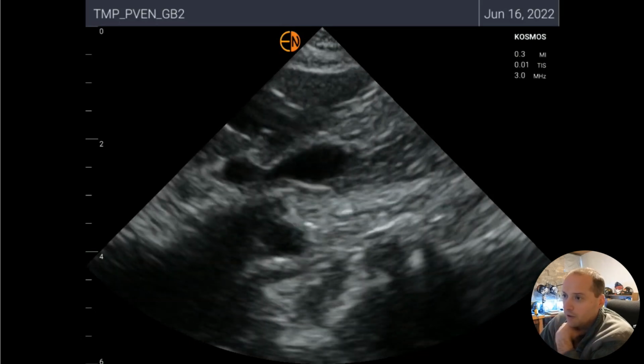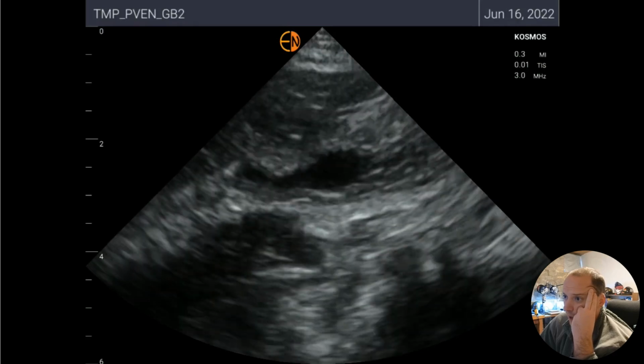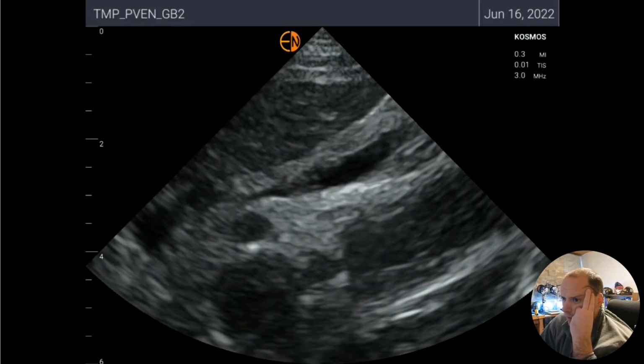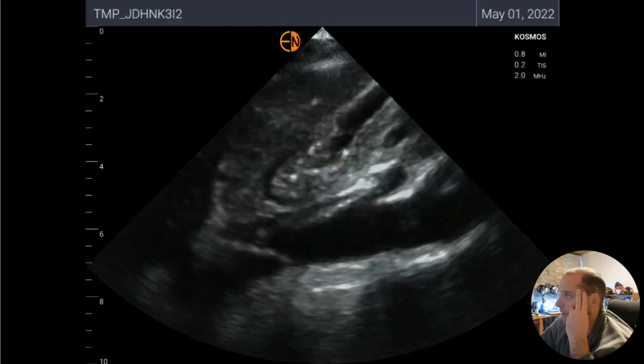So be very careful to make sure you find your landmarks: liver edge, aorta in the far field, and it needs to be adjacent to the liver wall. Having this huge gap here and something peristalsing over there, you're going to get confused and may think of that as being a full stomach.